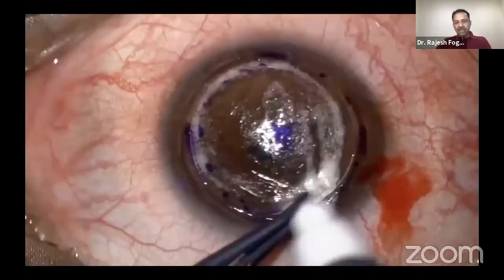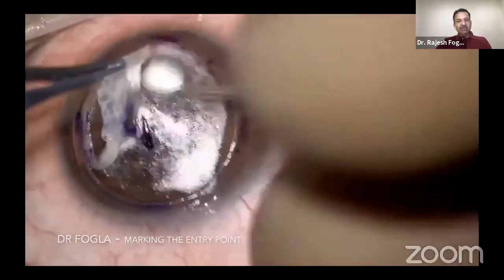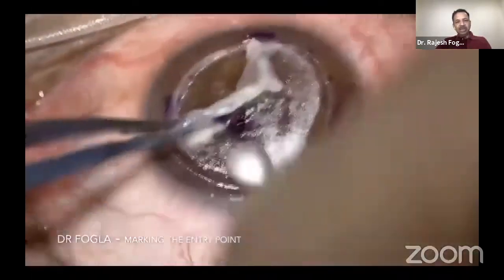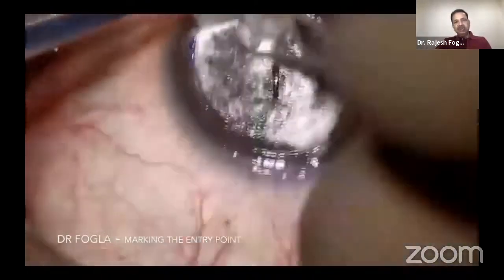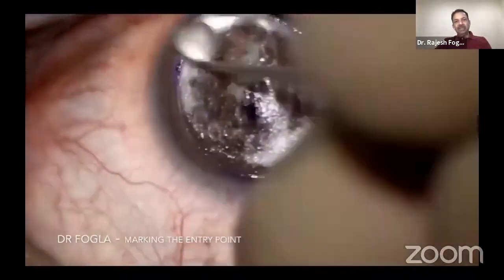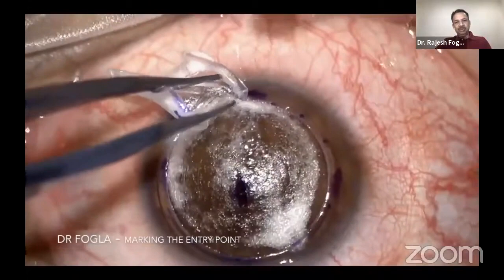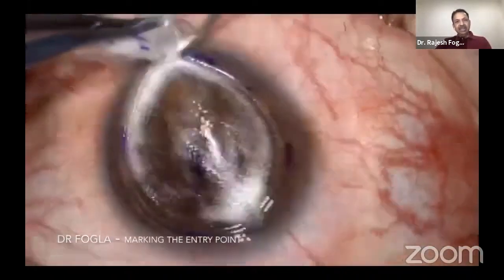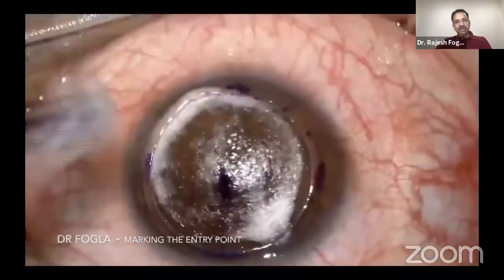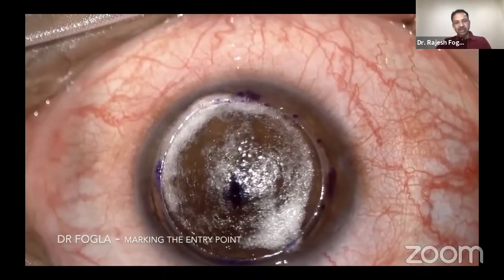Now, this is a case where we had a post-LASIK ectasia. The apex was very thin, so I did not do a debulking. I deflated, but before I did, I marked the point where I deflated. Because sometimes you deflate and then you do your debulking, and then you cannot find the point where you deflated or where you entered into the space of the type 1 big bubble. So if you mark it out, you can come back when you have to enlarge it, and you can see which is the point.